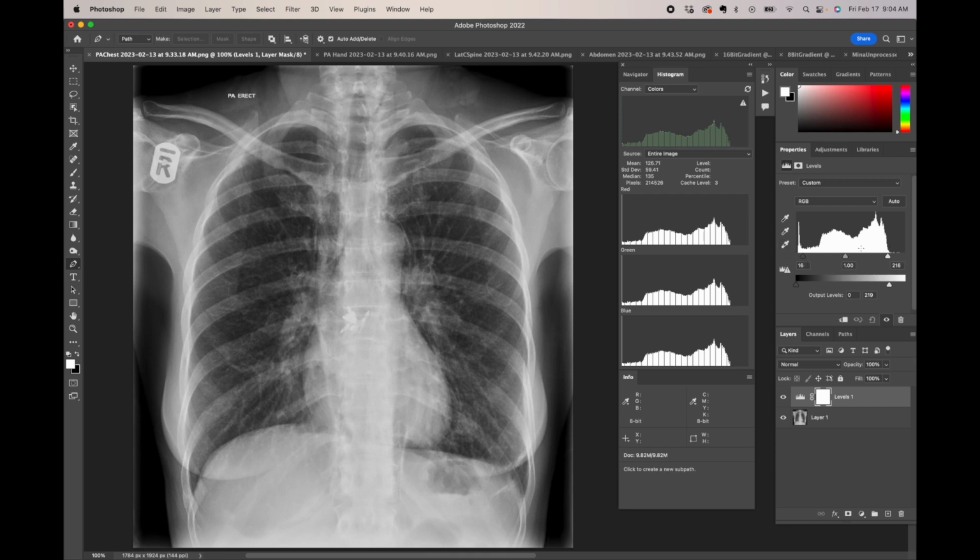Also, I'll point out that Pascal taught us that with a histogram, the more vertical values represent the brightness and the amount of pixels where that specific value lies in the table. And the amount from left to right, that's your window.